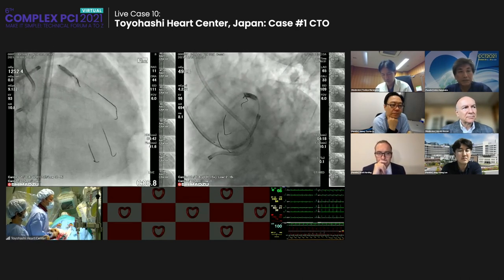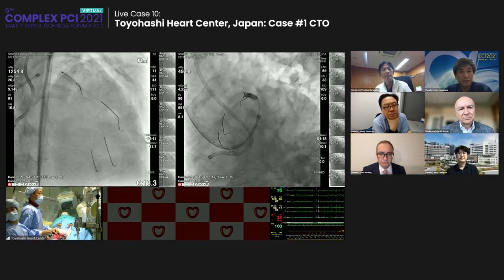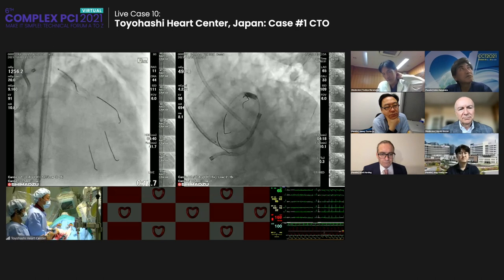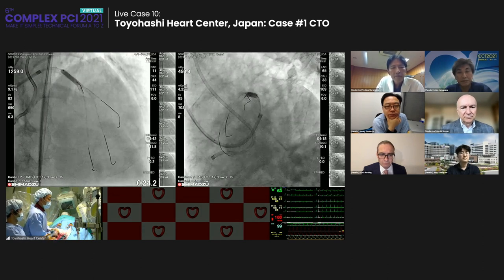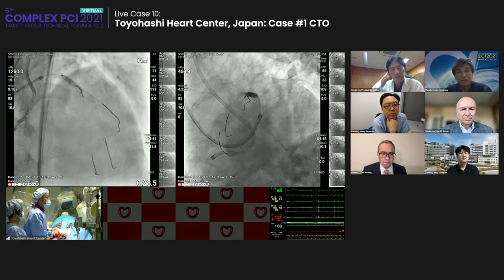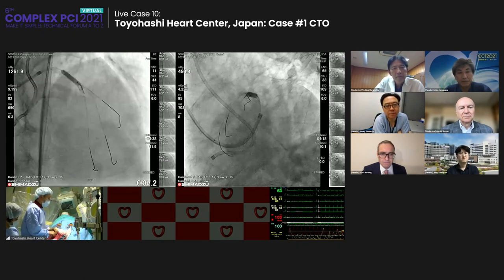Plasma is not risky, but if we can ablate a very different side of the plaque, we can make it lesser perforation easily compared with the mechanical guide wire. So the safer way is very important. So maybe next year we can start the clinical trial of plasma ablation in Japan.